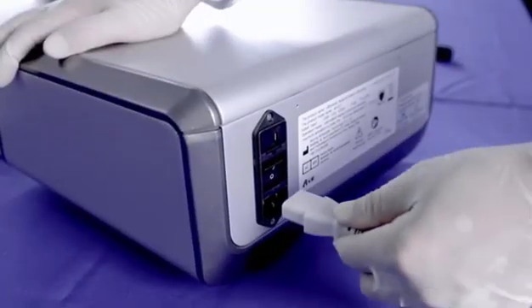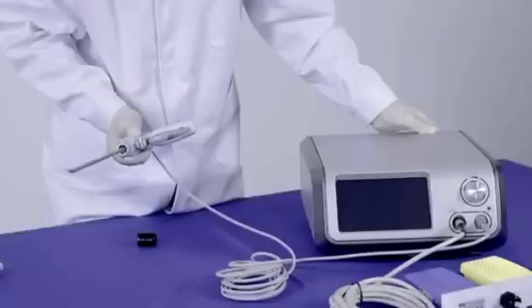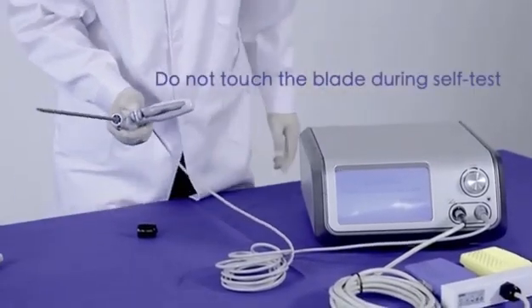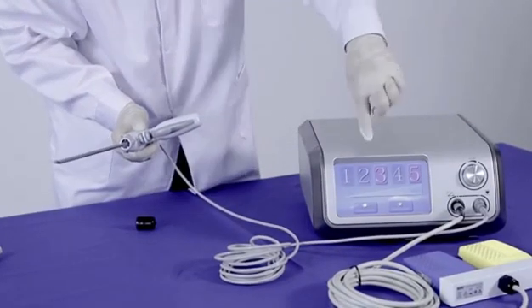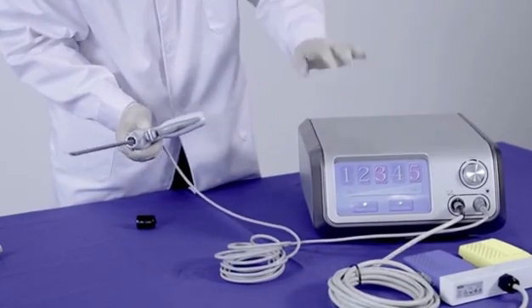Connect the power cord to the generator and to the grounded electrical outlet. After the completion of assembly, turn on the generator. The generator will conduct a self-test. Do not turn the generator power on before the scalpel, transducer, and foot switch are connected to the generator.